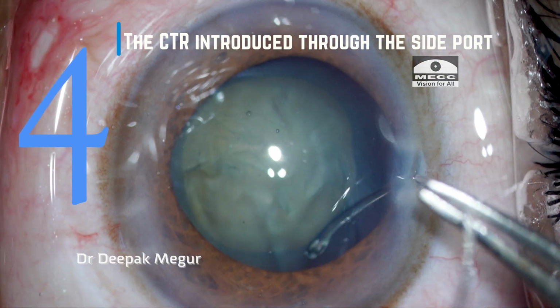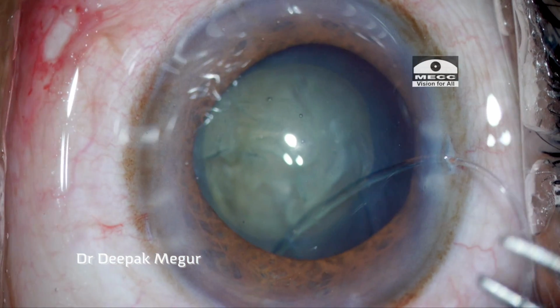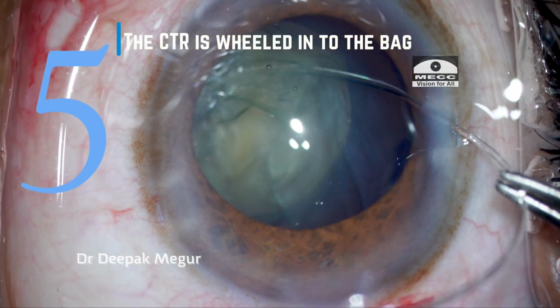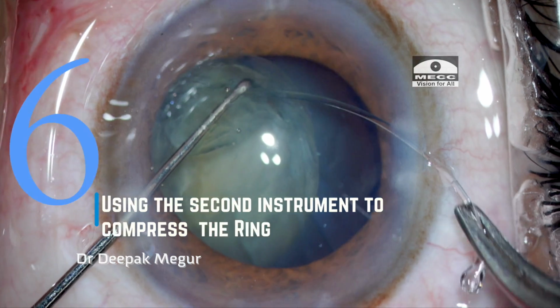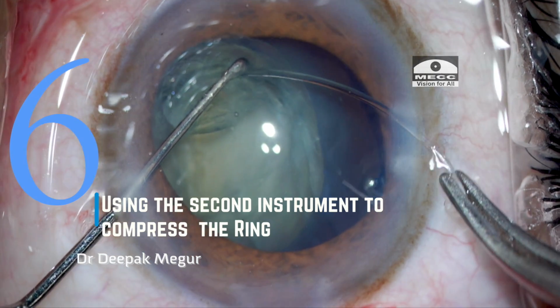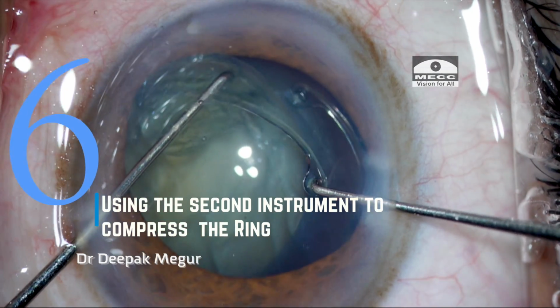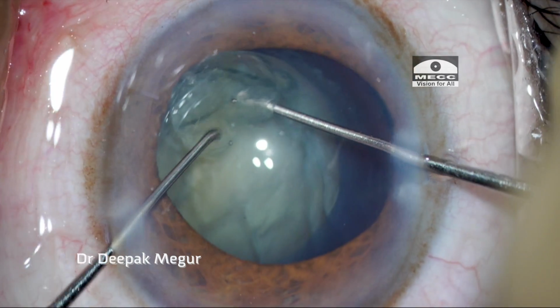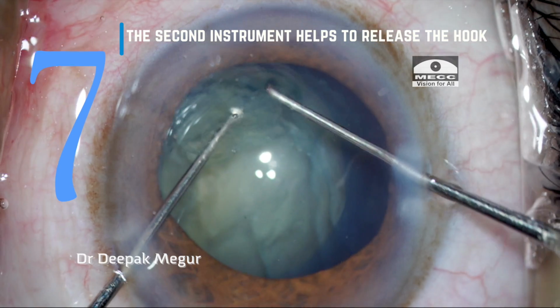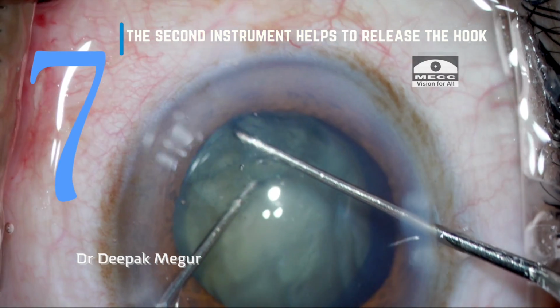The ring is held by two McPherson forceps and introduced into the eye through the side port and gently slid under the rhexis margin. The CTR is then wheeled into the bag, and once more than 1/3 of the ring is introduced into the eye, the second instrument is introduced. The second instrument, usually a Sinskey hook, is used to compress the ring during insertion. This will minimize the stress induced on the zonules. The final part of the ring is then guided under the rhexis by using another Sinskey hook, and the second instrument helps to release the ring if the hook gets stuck.